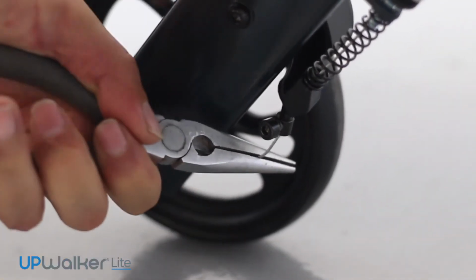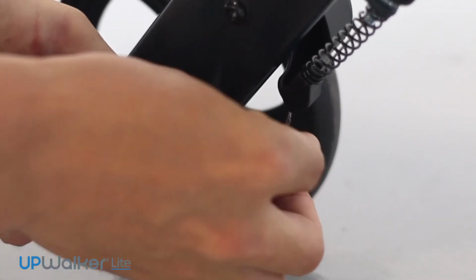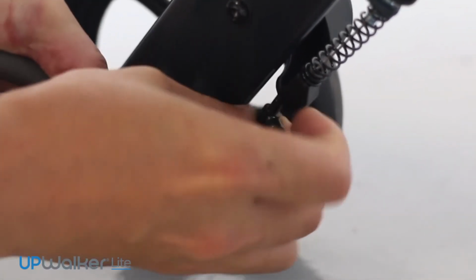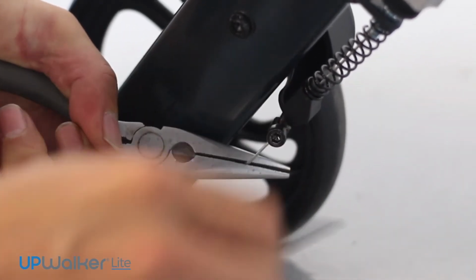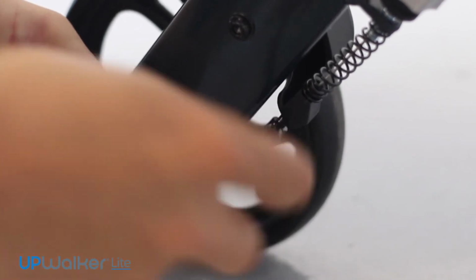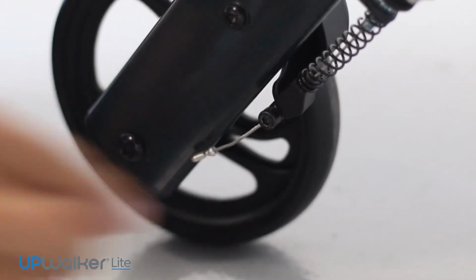After achieving the desired cable length, tighten the set screw by turning the Allen wrench nut clockwise. You may have to repeat the adjustment a few times to get the right gap between the brake pad and the rear wheel by visual sight.